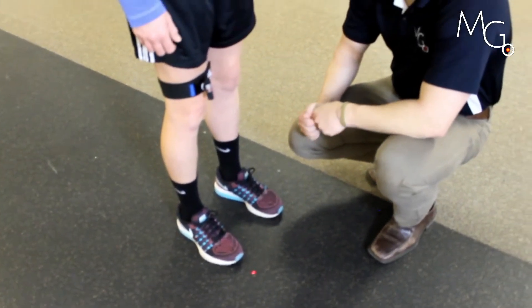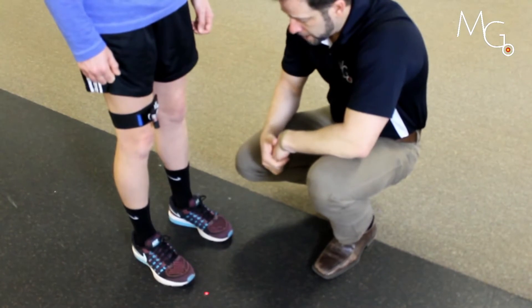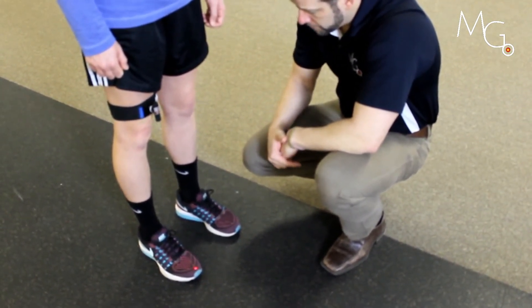This can be deceptive when working on terminal knee extension during gait. So try to move that laser back onto your shoe if you can by tightening and pushing back that knee. There we go. And then relax.